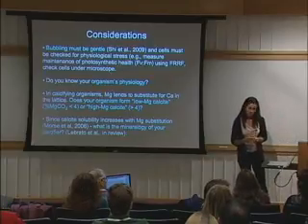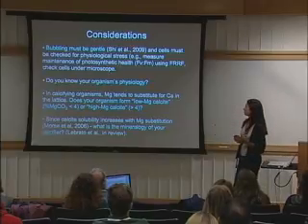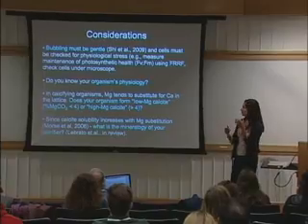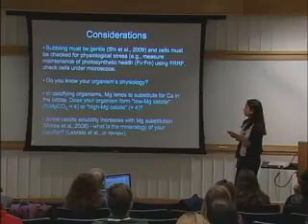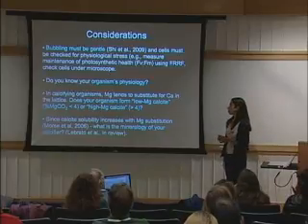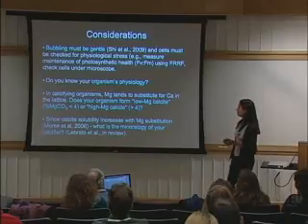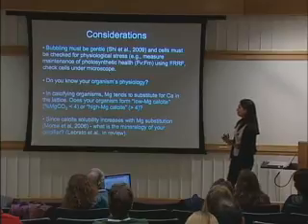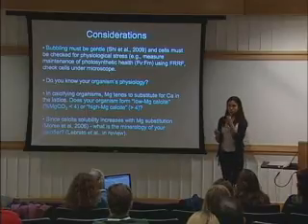Okay, so just to emphasize that bubbling must be gentle, or you must bubble elsewhere and then use that preconditioned seawater in your culture. And cells have to be checked for physiological stress. Remember that some cells can form cysts, and some cells can be disrupted by an abrupt change in condition, or by robust, vigorous bubbling. Just ask yourself whether you know your organism's physiology, and try not to make assumptions.